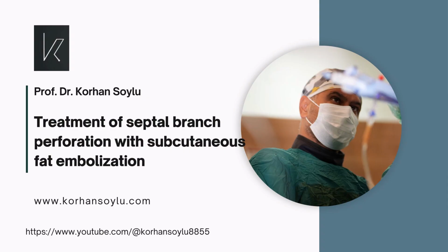Furthermore, advancing fat tissue through the microcatheters is not easy. Therefore, a laboratory equipped with all available alternatives and operator experience is crucial for managing perforation.